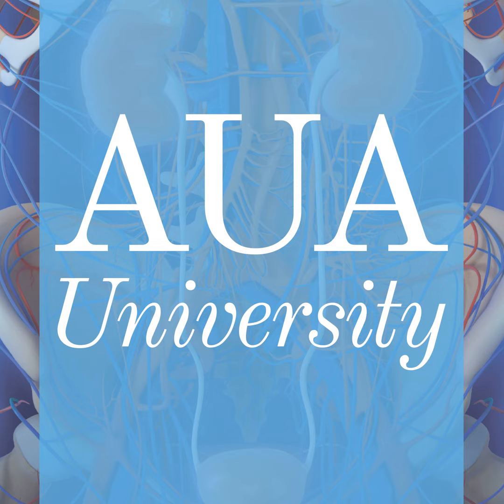So in primary staging, you will receive the information it's a T3a tumor. There is one positive lymph node in the obturator fossa on the left side, but there is no evidence of systemic metastases. On the other hand, in patients who have biochemical relapse, this type of PROMISE classification gives you the idea there is no local relapse, there is no lymph node metastasis. However, there is a positive metastatic spot in the retroperitoneal lymph nodes.